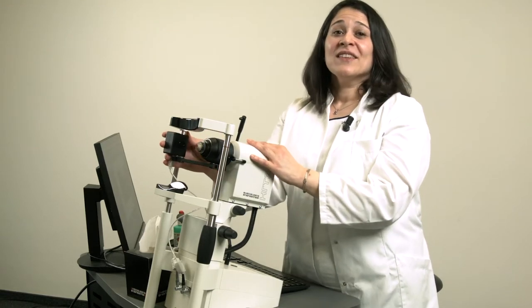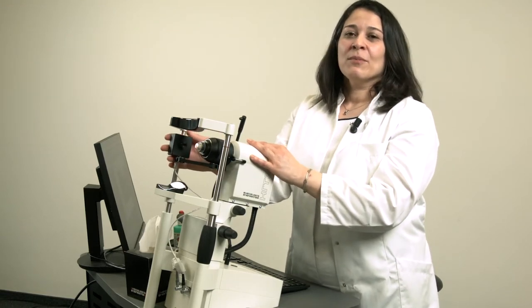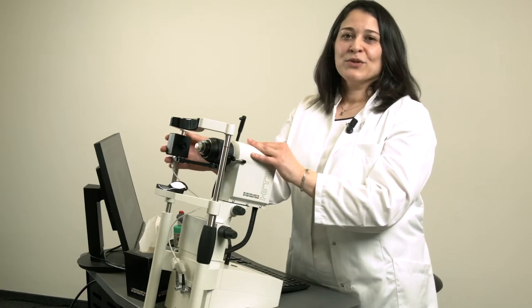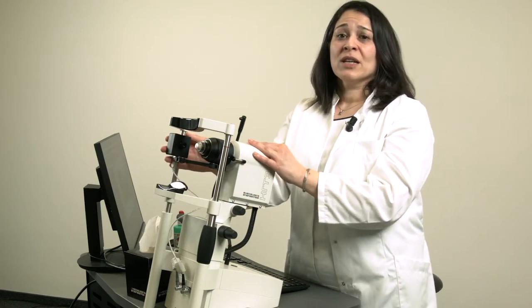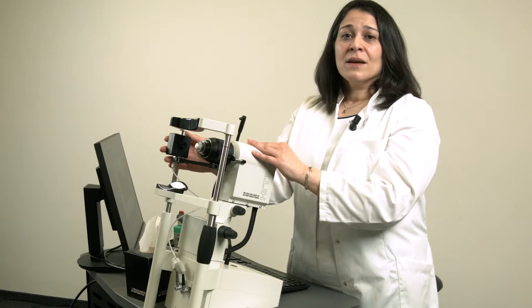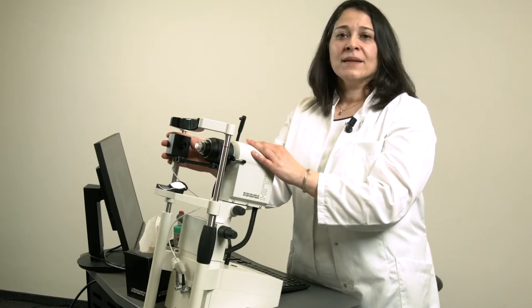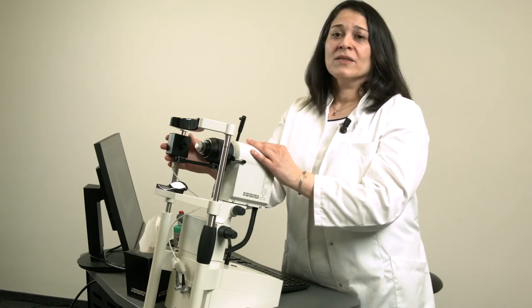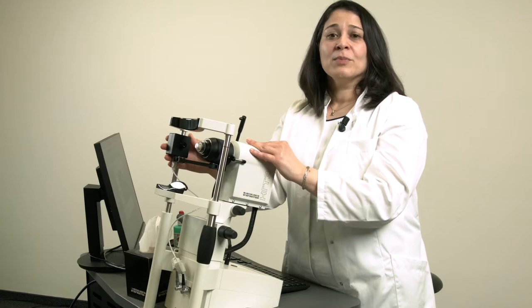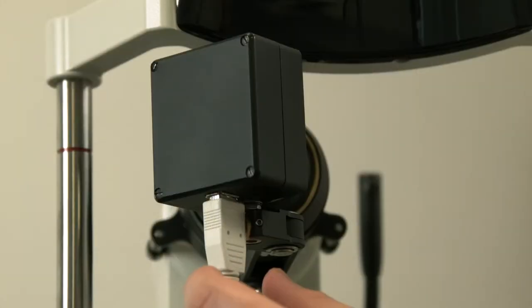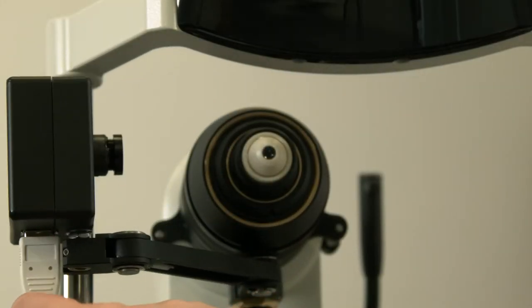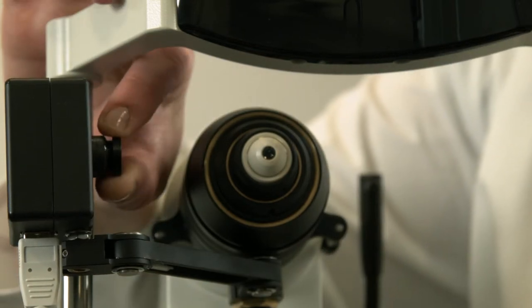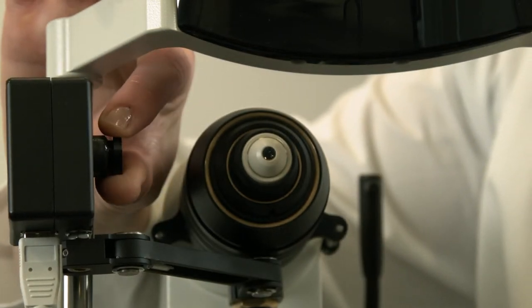Here you see the CCD camera that is attached to the RCM objective, which will later be used to check the distance between the RCM objective lens and the cornea. The CCD camera is aligned 90 degrees to the anterior surface of the RCM lens on the side of the eye to be examined. On the front of the CCD camera there is a small wheel with which you can adjust the focus of the camera image.